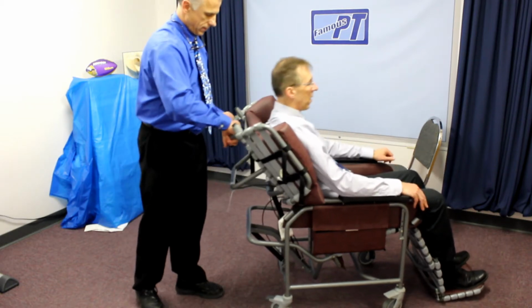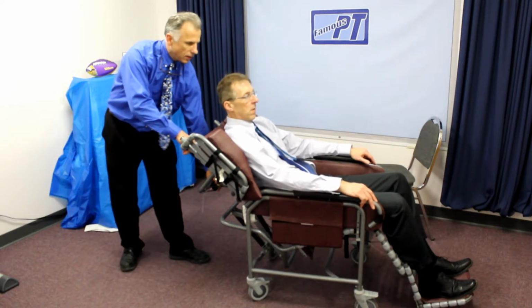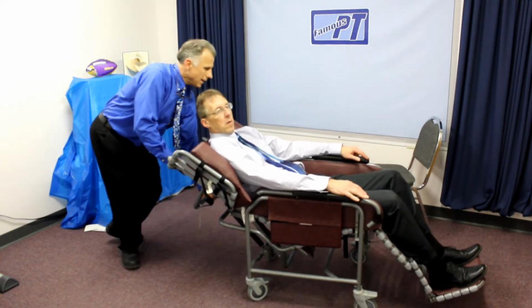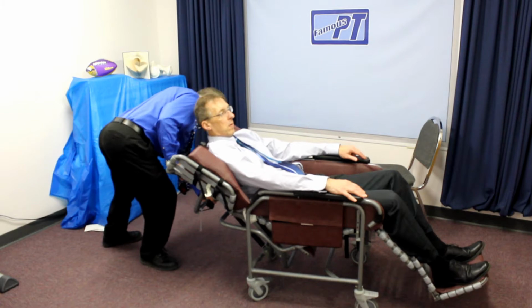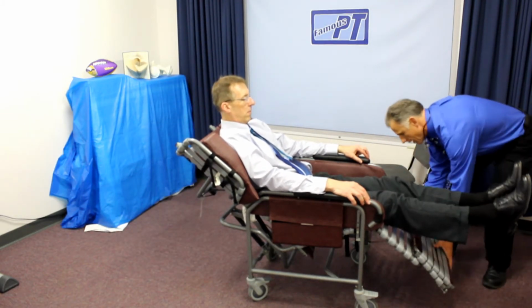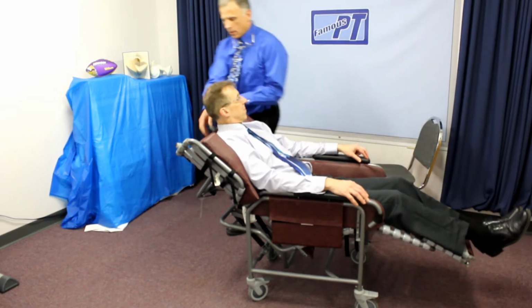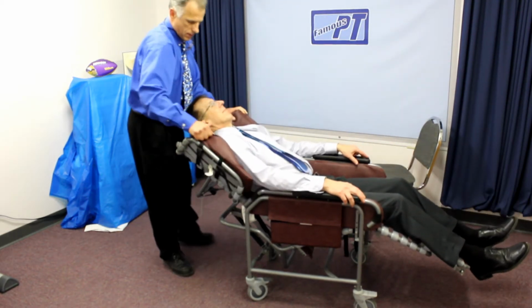Okay, Bob, how you doing? Yeah, it definitely adjusts the pressure areas. Right. And then there's another one, it drops way down. Okay, now let's get this foot up. Let's get your recline back so you can actually take a nap in here, Bob. There we go. Lift this up.